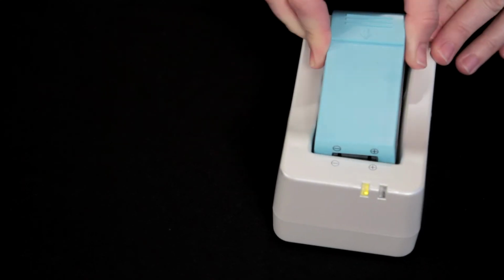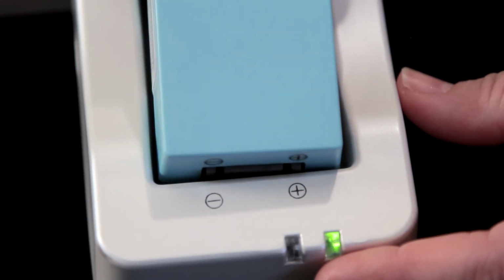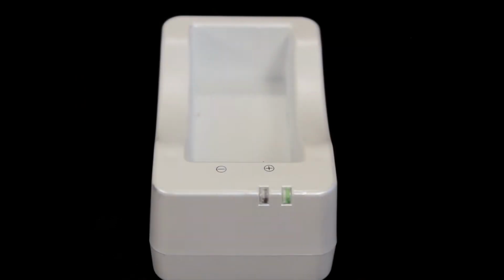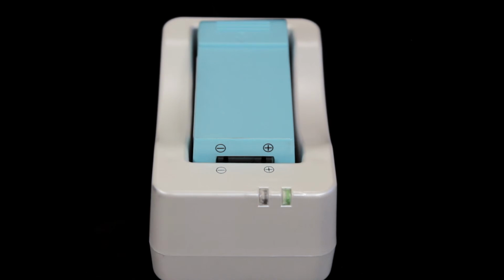To charge the battery, put the battery into the charger and ensure it is placed properly. The connection between the battery plug and the socket of the charger must be correct. Connect the charger with the power supply before charging the battery. The amber light will turn on when the battery begins charging. The green light will turn on after the battery is fully charged. It is suggested to charge the battery for at least 2 hours.